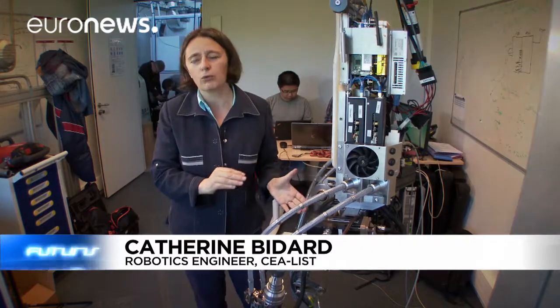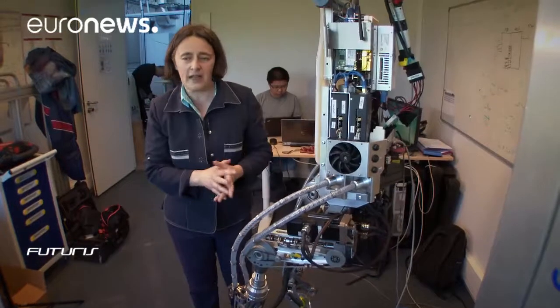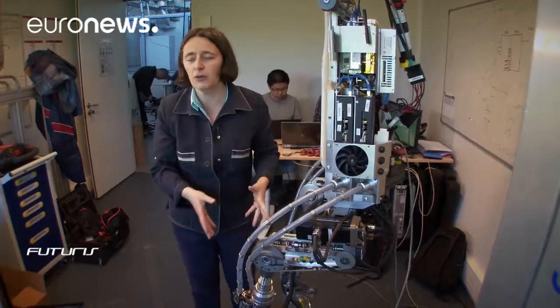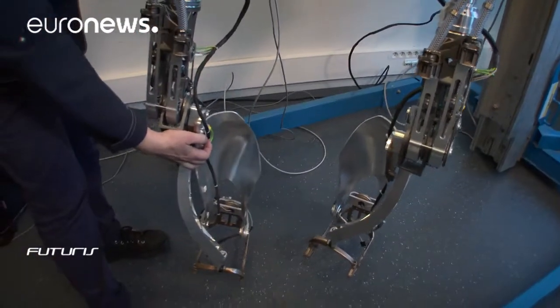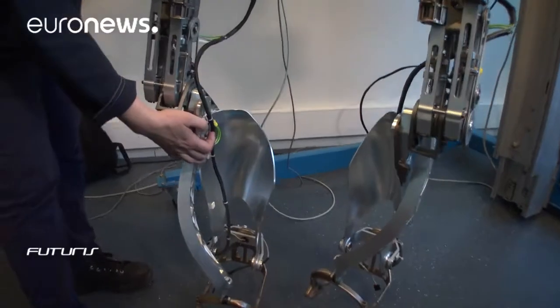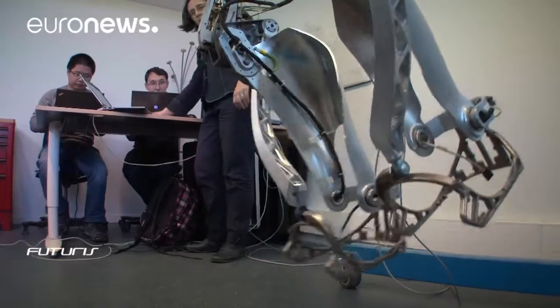This machine is developed with actuator technology that controls the effort and not just the position. What's also particular about this is having 4 motorized axis points per leg. Here is a side movement of the hip that will make it possible to regain balance or to turn. Keeping balance is a big challenge.